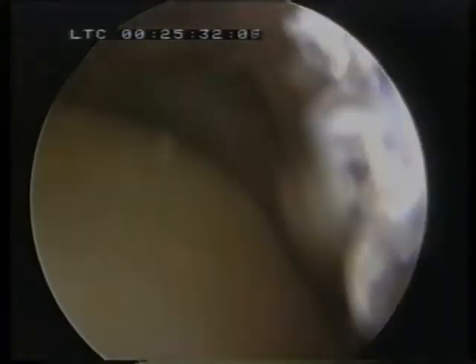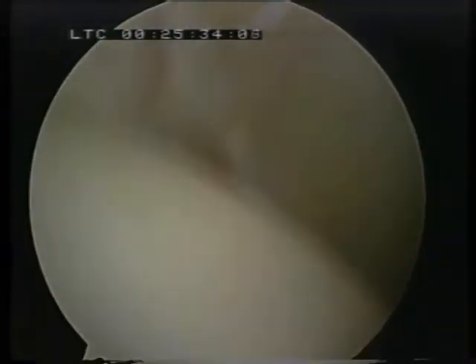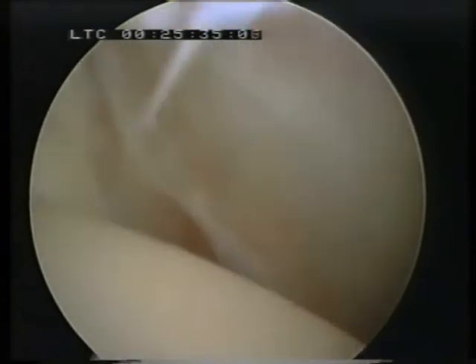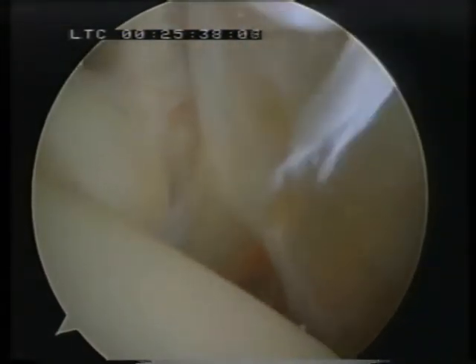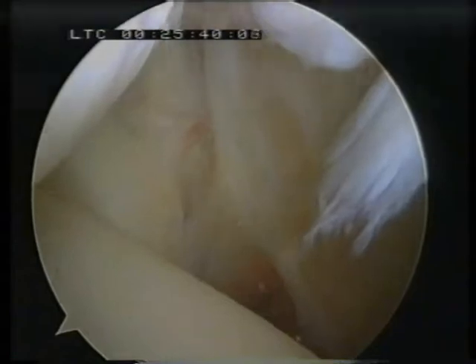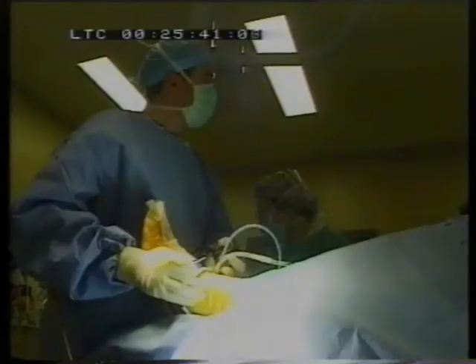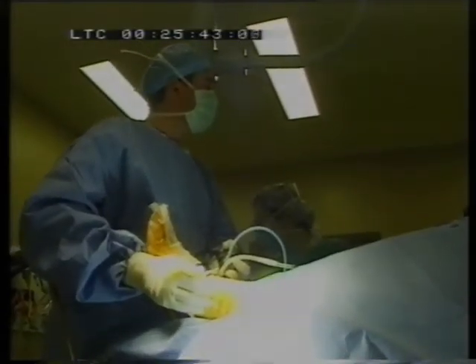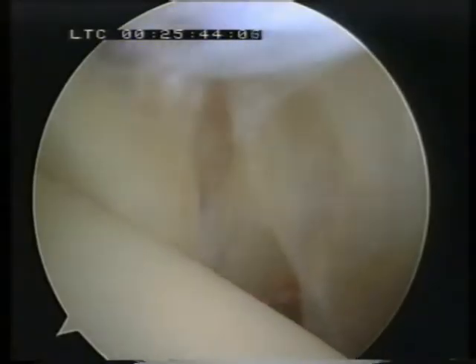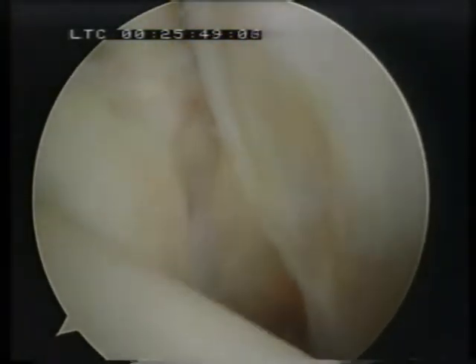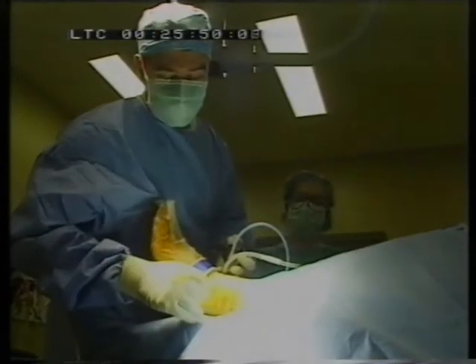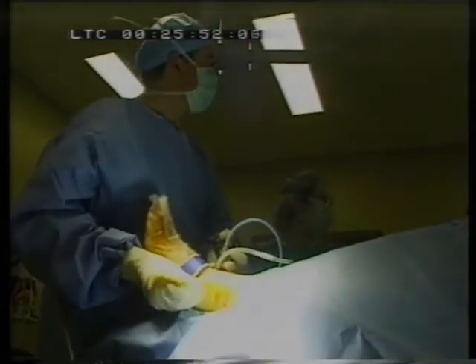You quite easily see synovial folds, which are over the deep blade of the medial collateral ligament. The next important thing to do is to place your portals. I try to get the portal as lateral as I can, and first of all I just press on the outside of the ankle in order to identify where a good position would be, and then pass the 22-gauge needle from the lateral aspect into the joint.